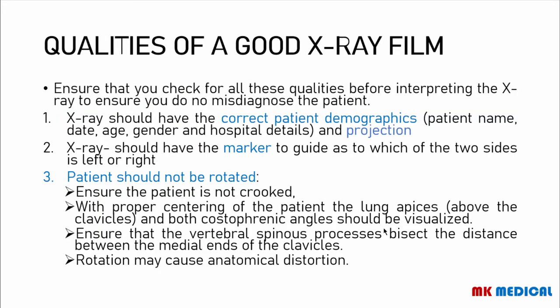So here's a summary of the good qualities of an X-ray film. This is what you must always pick out before you actually start reading your chest X-ray. So you ensure that you check all these boxes before you start reading your X-ray. Even when you're asked on the wards, can you read the X-ray, you should comment on these things first.